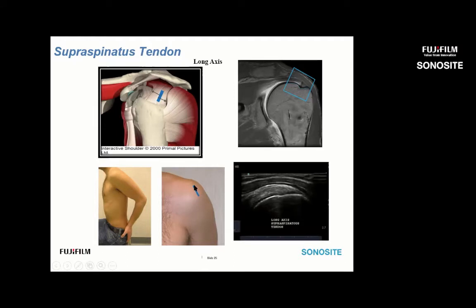We want the superior end of the transducer oriented slightly toward the patient's ear. As we internally rotate, those tendon fibers that normally come out in a coronal MR plane rotate more anteriorly — so the transducer position is slightly more anterior than you might think. Once positioned, we see the humeral head, overlying hypoechoic articular cartilage, the footprint of the greater tuberosity, and this characteristic bird's beak view of the supraspinatus tendon. The anatomical neck is located here and will be more pronounced, with more of a step-off from humeral head to greater tuberosity.